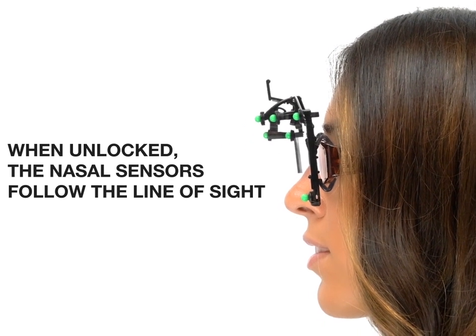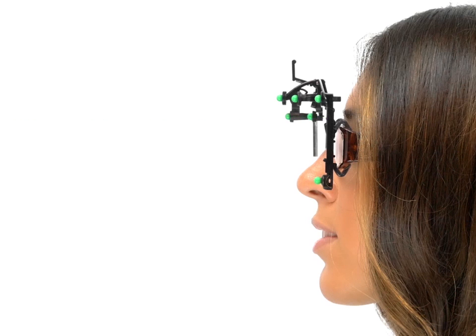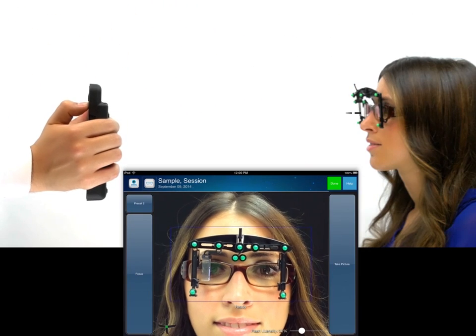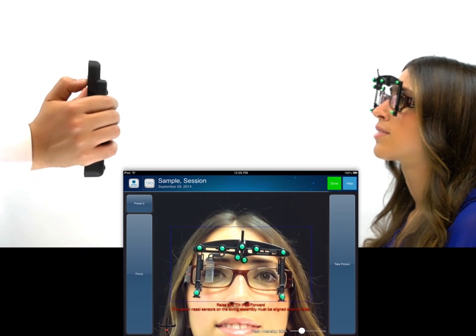The locking process is the equivalent to dotting a patient manually. The same care and attention are required to analyze the patient's posture prior to locking the swing assembly. If you have judged that the patient is not in their natural posture, guide them to changing their posture using standard opticianry techniques prior to locking. When ready, apply a slight pressure on the brake arm to lock the swing assembly. Now that the posture swing assembly is locked, the patient does not need to be at the same eye level as the camera lens on your tablet.